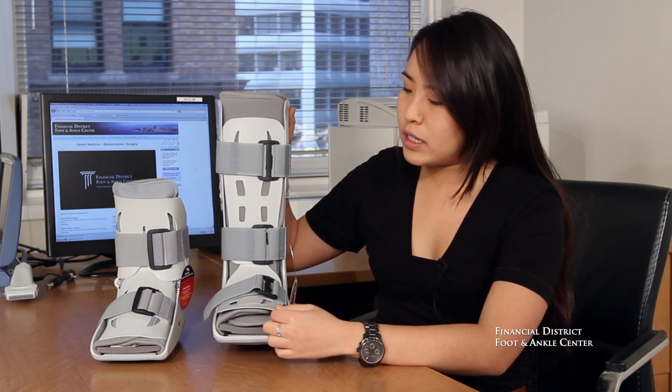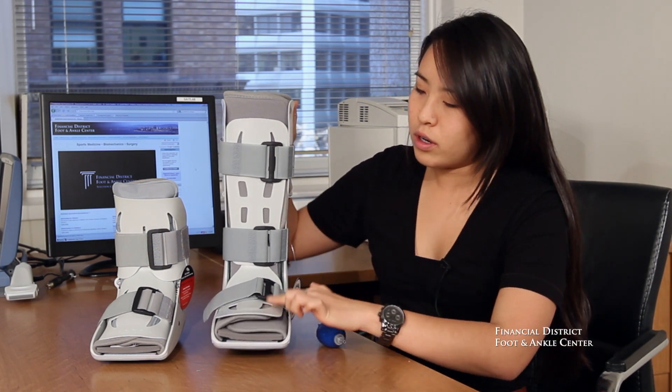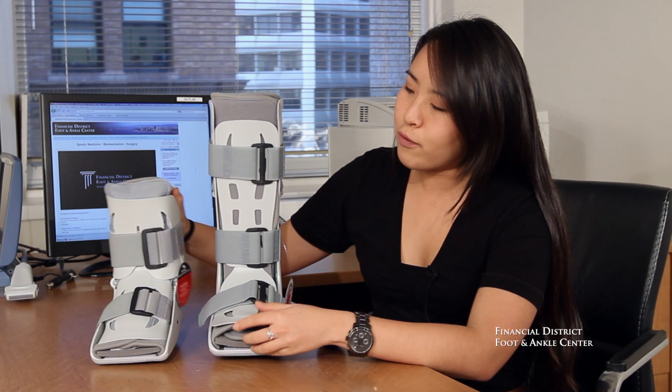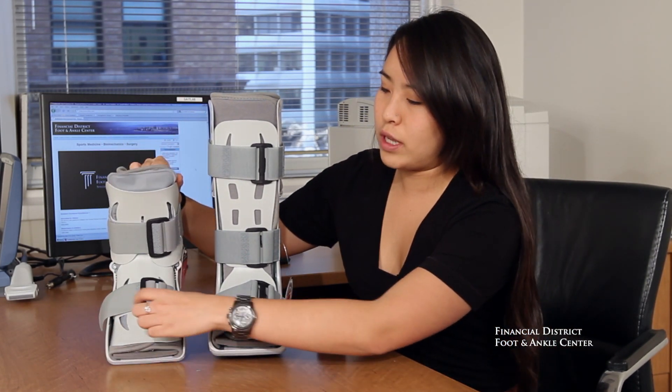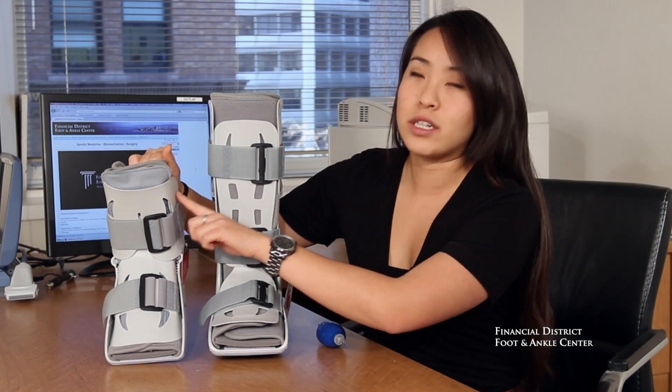And the last difference is that the front piece cover, as you can see here, is different from the short leg air cast in that it doesn't fold into the outer shell or attach to the top — it just comes across the front of the foot.